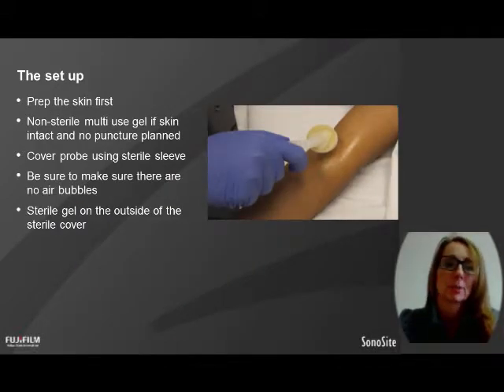So when you're setting up to do your scanning, I think in the dialysis unit it's probably best to just always cover your probe. If we're scanning fistulas, even though they may have not been punctured today, they've got scabs on them and they've got healing puncture sites. So it's just best to cover your probe, and that way you're not risking contaminating your probe and then someone may be picking it up and using it on someone else with a bit of debris or something on it.